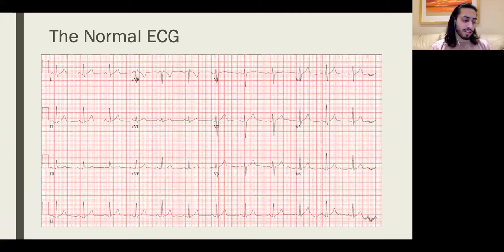If we look at this ECG, you may be asked to present something like this on the ward round. And what you'll do after you've calculated your rate, rhythm, and axis, you're going to have to look at the P wave, PR interval, QRS complexes, any ST elevation or depression, and then the T waves, and see how it's going from there. And you basically just cast an eye over all the leads, and you start off with the rhythm strip always. And then you go systematically.